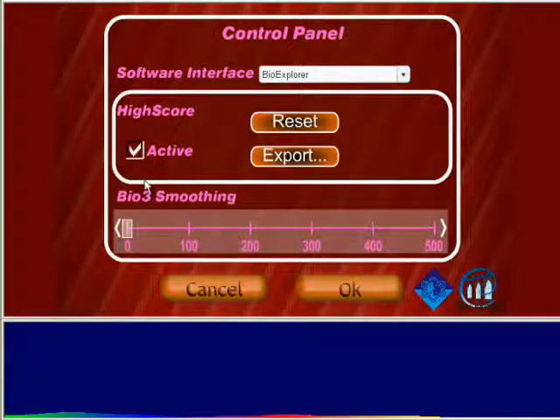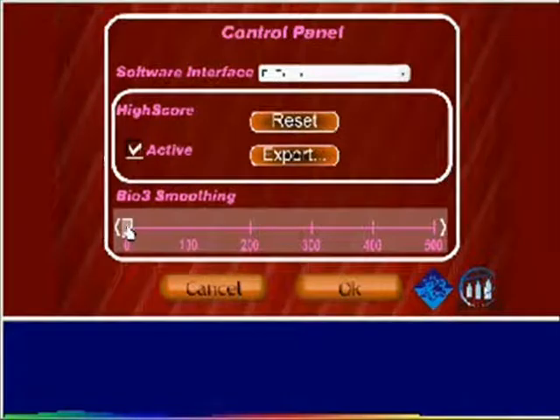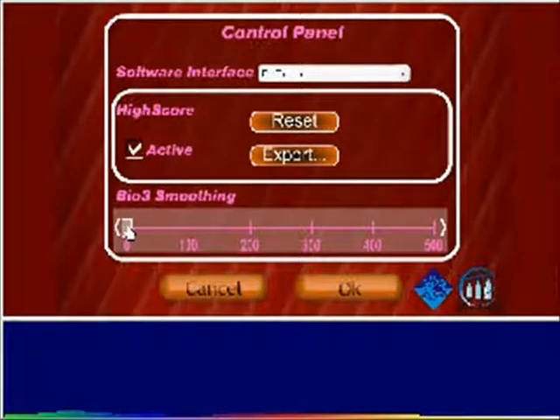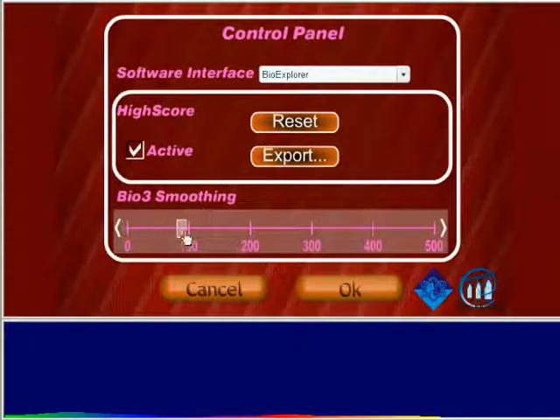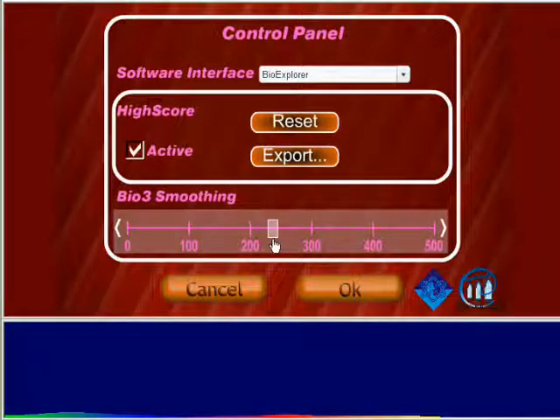The control panel includes an average slider for smoothing feedback. We offered this because fast feedback like EEG will sometimes seem too fast, in which case you can make responsiveness adjustments. This won't affect the quality of feedback because Bio1 and Bio2 are always instantaneous. Set this up to 500 milliseconds, averaging as desired.